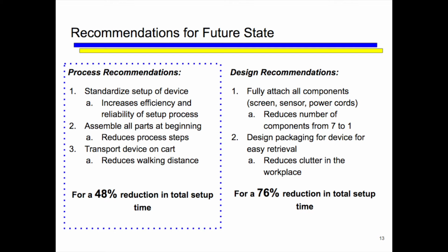For a design recommendation to the senior design team, we are recommending, number 1, that they fully attach all of the components permanently, reducing the total number of components from 7 to 1. We are also recommending that the device is packaged for easy retrieval of the device, and this would reduce the amount of clutter within the workspace. And we suspect that this would result in a 76% reduction in total setup time based on our work study.